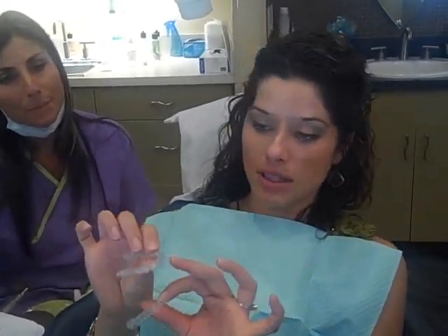You can see where this is like my trouble tooth that I really want to get adjusted, but you can definitely tell that he was right — the problem started more with the bottom, the sort of crowding, versus up here. But we have to fix here to make this better.